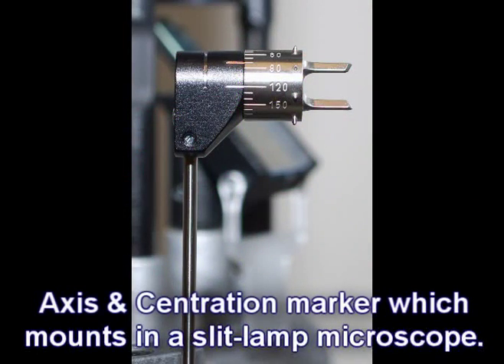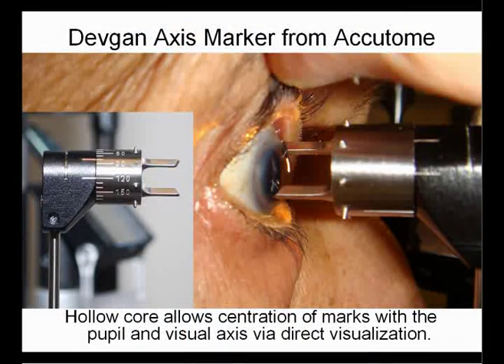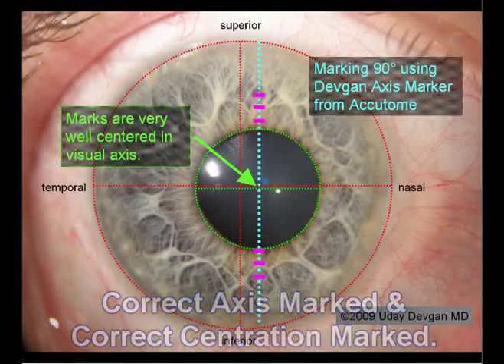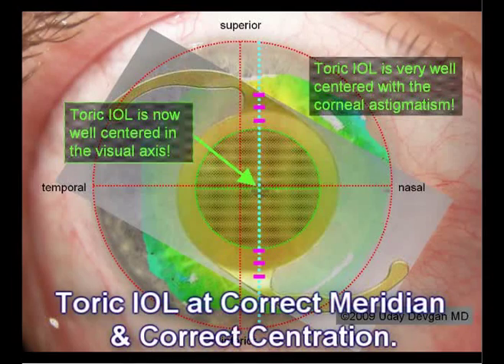This axis and centration marker mounts in a slit lamp microscope, and you note the precise degree gauge on its side. It also has a hollow core, which allows centration of the marks within the pupil and close to the visual axis via direct view. This makes things nice and easy. The marks are placed on the cornea in the correct meridian and centration, so the toric lens is now well-centered and at the correct meridian.